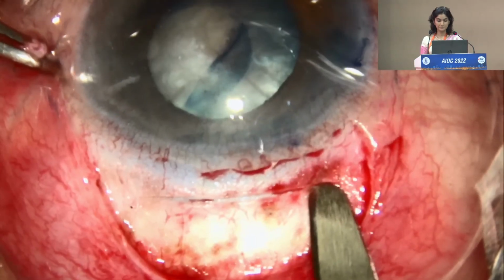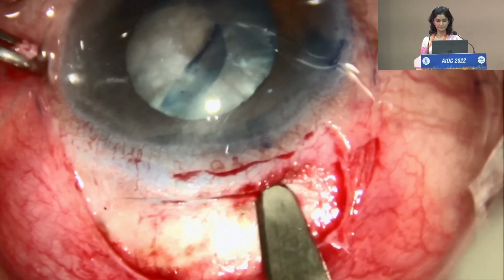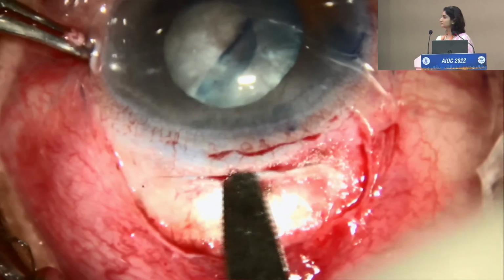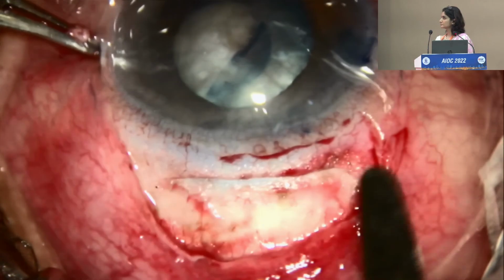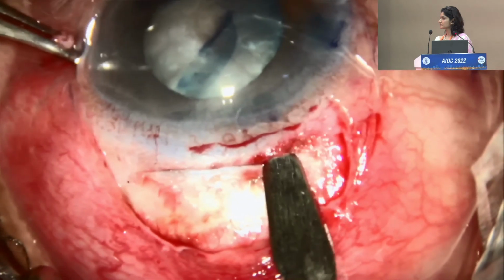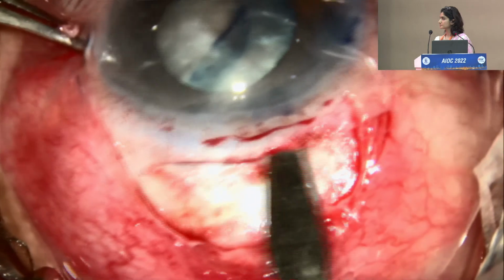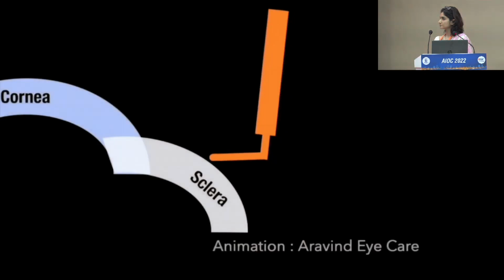Next, gauging the depth of the wound is most crucial for a beginner. Here I am dipping my crescent heel up. The depth of the wound should be as much as the depth of the front slant cutting edge of the crescent. The crescent blade is made in such a way. Make sure that you open the mouth of the groove all along the length of the incision with the same depth. Now proceed with the dissection.